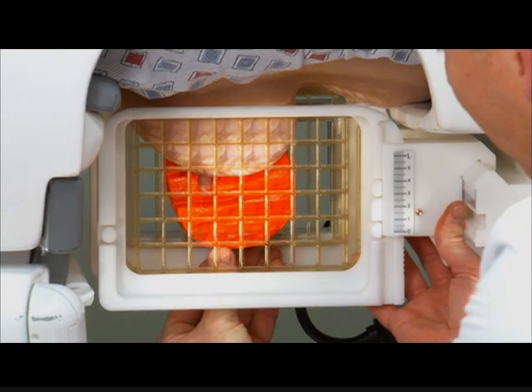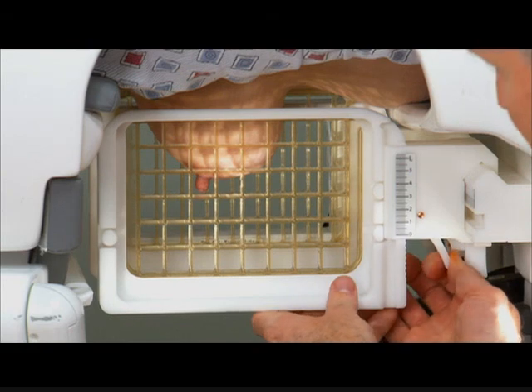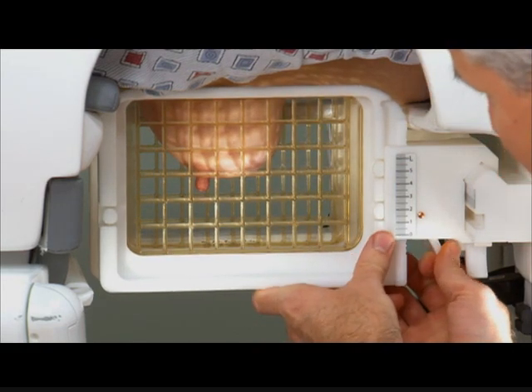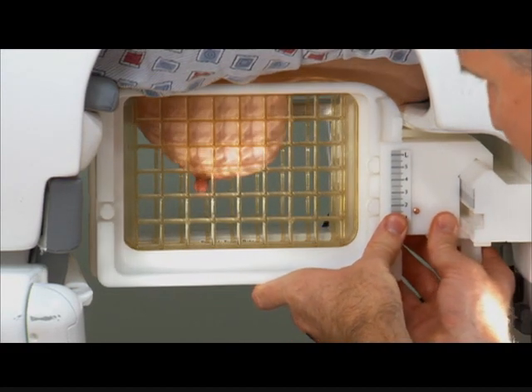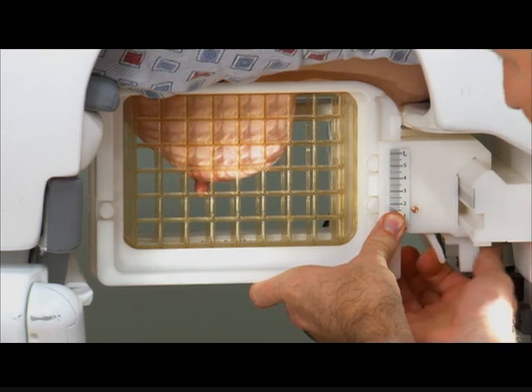This is somewhat of a mid lesion. It's positioned centrally within the breast. As we cross-reference, you can see it's pretty much centrally located within the breast. So in this case, you could do either a medial or lateral approach. In this particular instance, we chose a lateral approach.